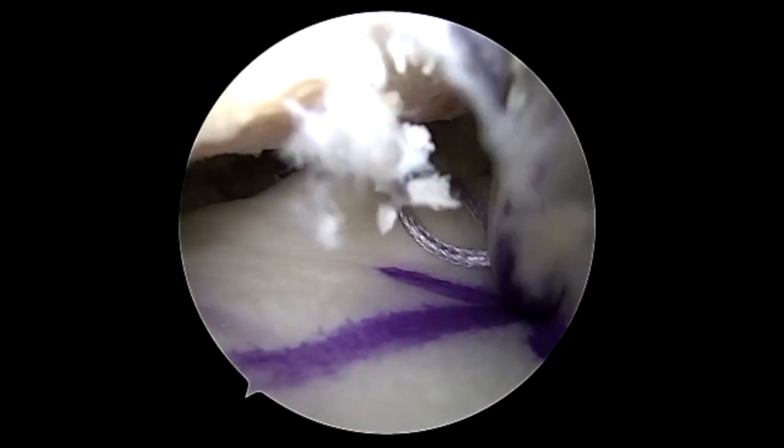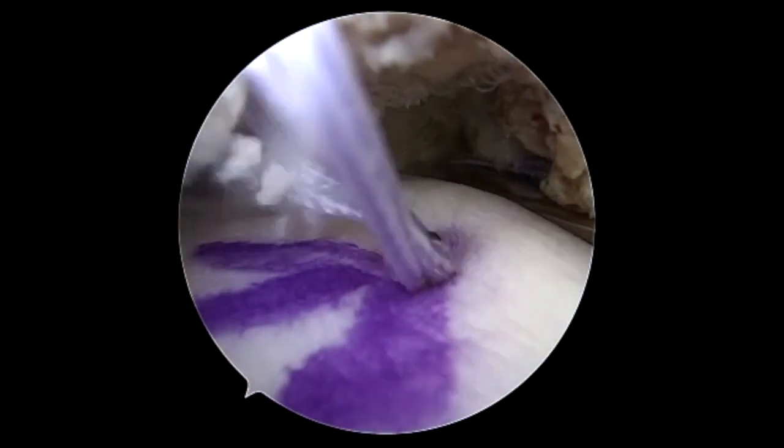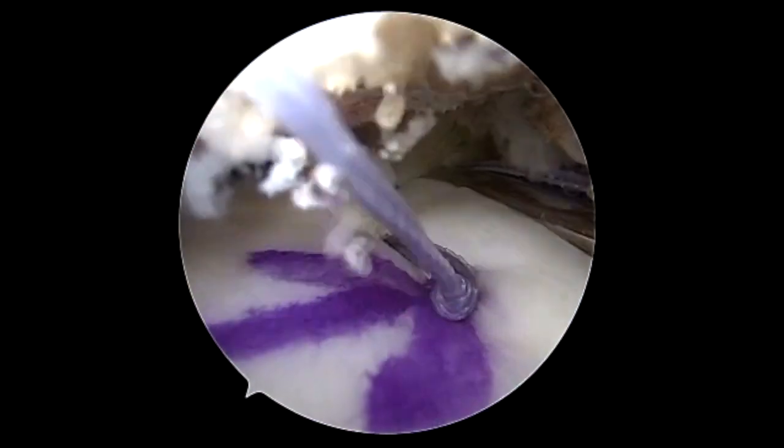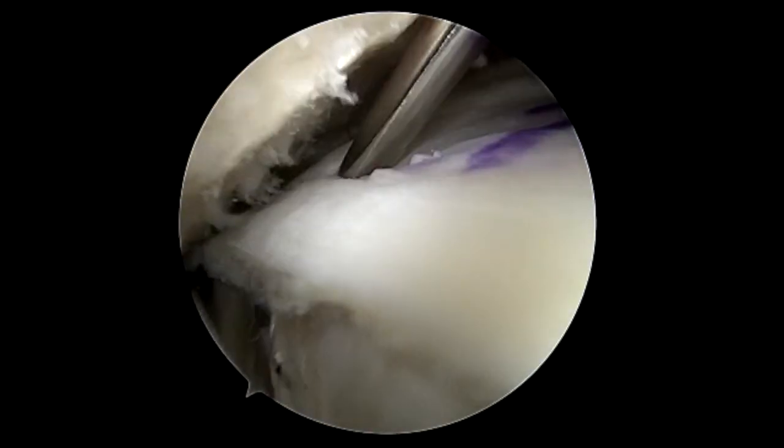We're going to go in once, fire it in twice for a double fixation — you can see here. We're going to tension this down and then use the secondary stitch to tension as well, and then cut it. Then we're going to go to the posterior aspect and fix it on the medial margin.